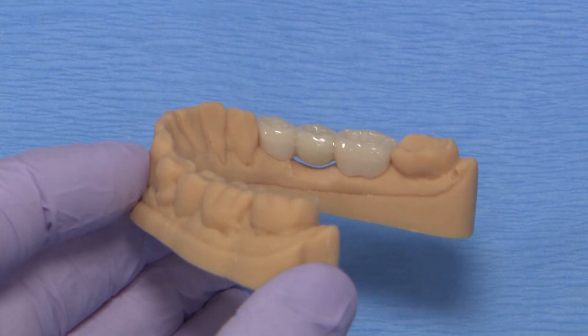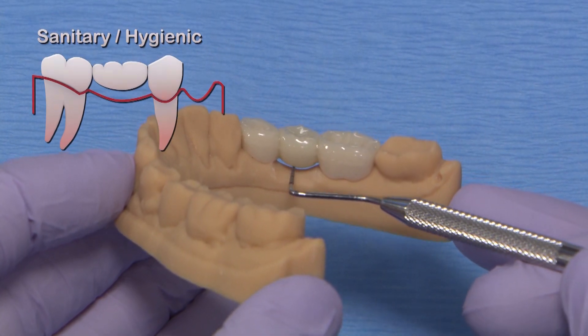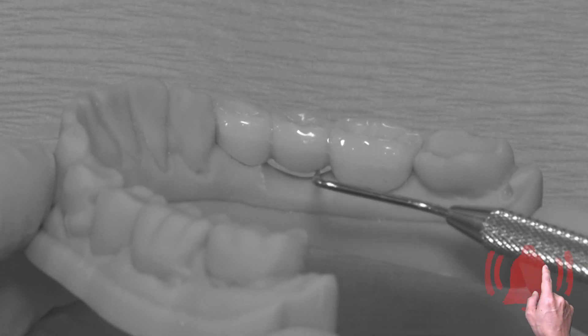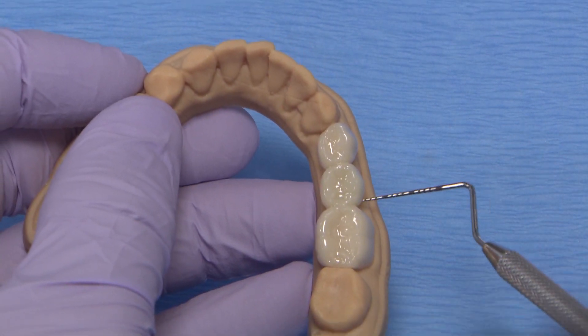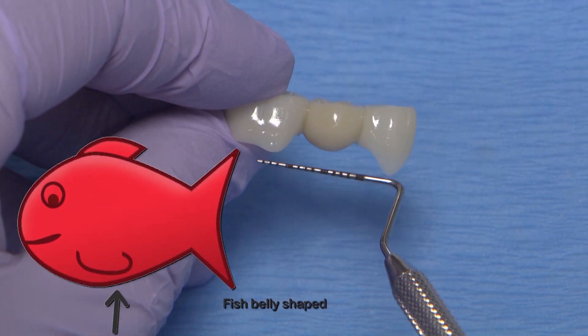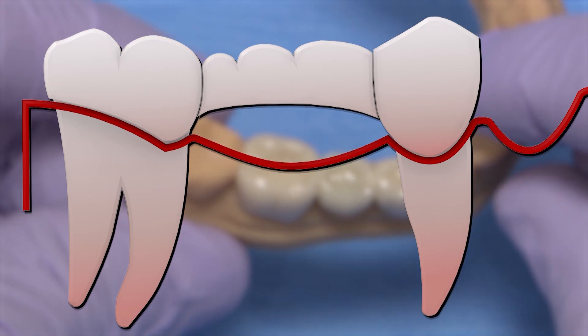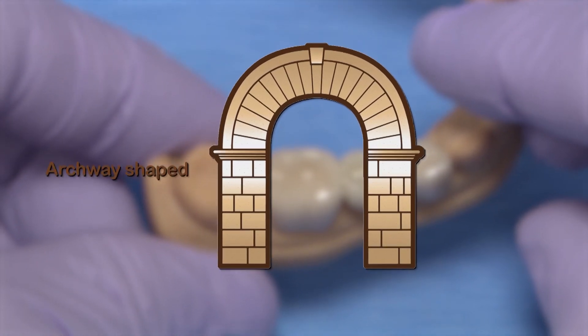The final design I'd like to talk about today is the hygienic, also called sanitary, pontic. This design is easily cleansable and ideal for the health of the tissue, especially new surgical sites. However, it is not at all aesthetic. It could lead to food entrapment and can become annoying to the tongue over time. This shape is loosely known as a fish belly. It can also be modified to shape the gingival portion concave to resemble sort of an archway between the retainers.